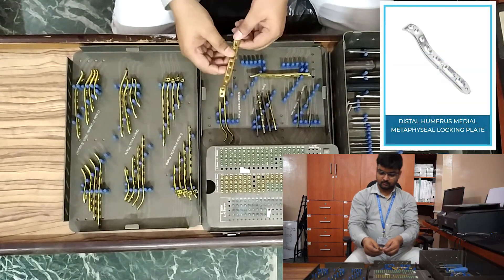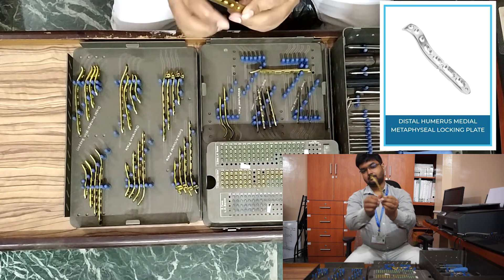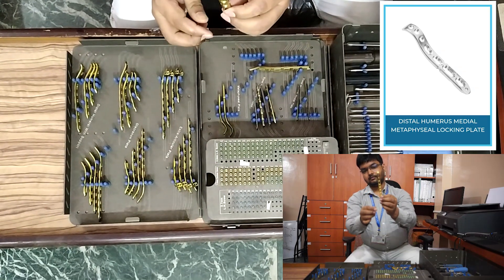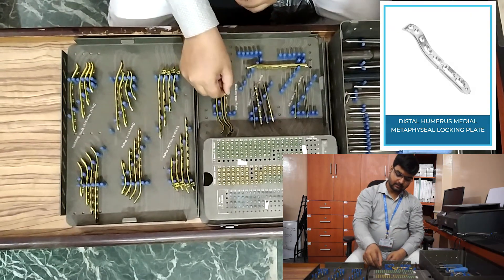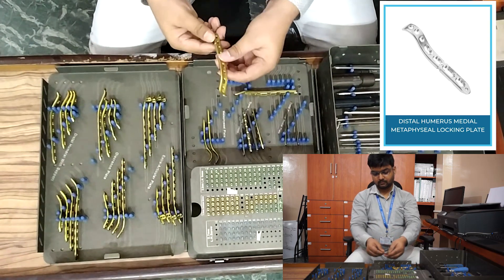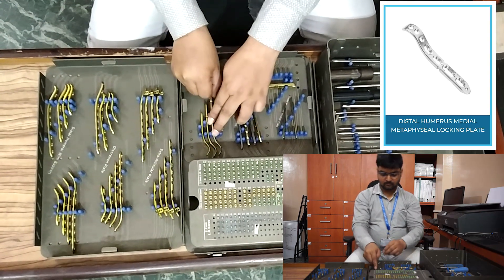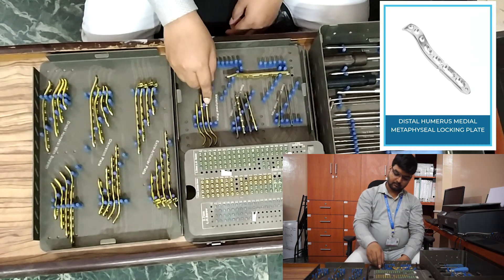Next, distal humerus locking plate medial plate — universal. This does not have a left side or right side. It comes in seven-hole, nine-hole, and eleven-hole. This is a universal plate.